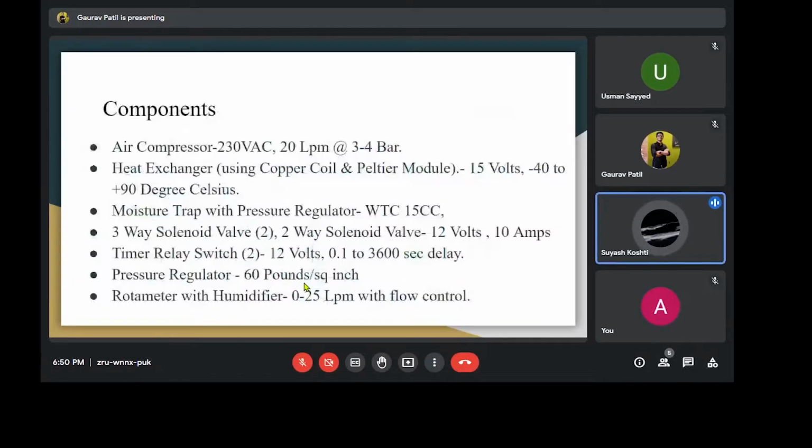So till now we have seen the working of an oxygen concentrator, what an oxygen cylinder and an oxygen concentrator are, and the objective of our project. Now let's look at the components required to execute this project. We need a compressor. A compressor is a device which converts power into potential energy, stored in pressurized air. An air compressor forces more and more air into a storage tank, increasing the pressure.